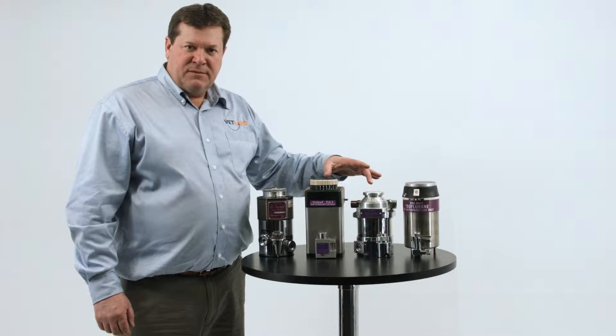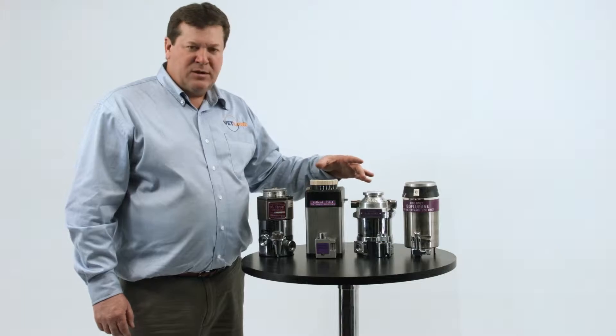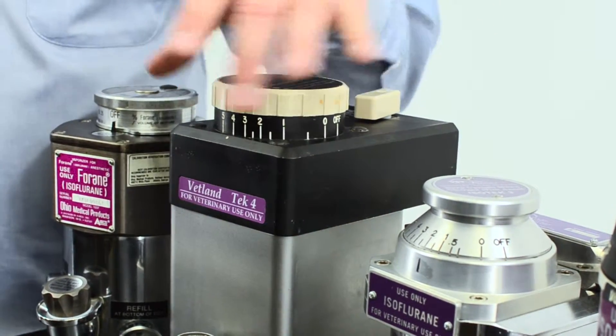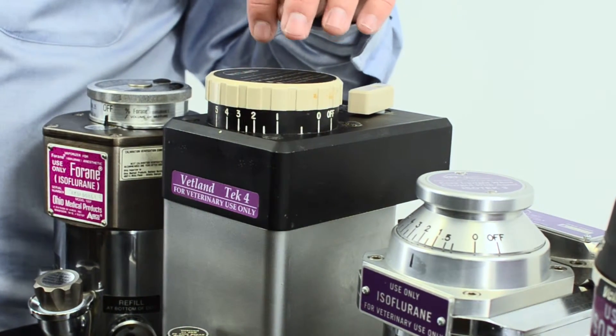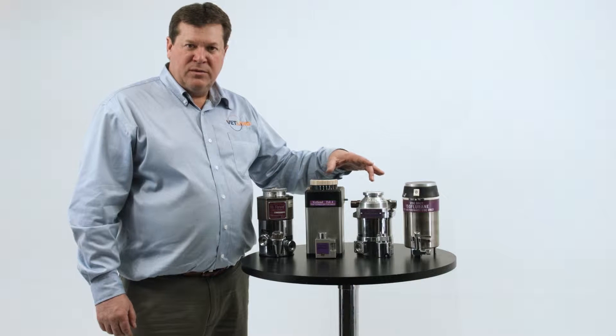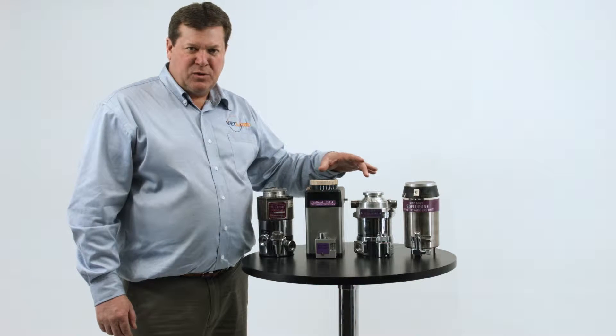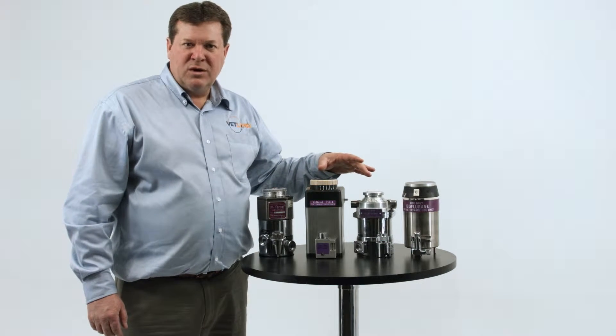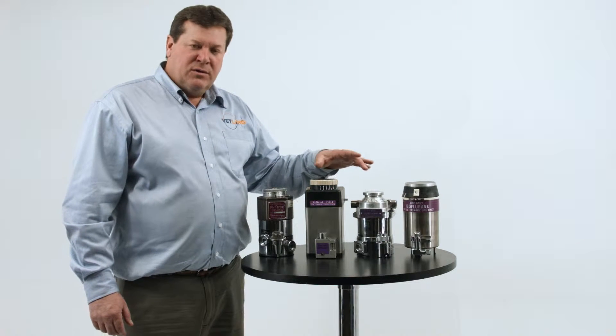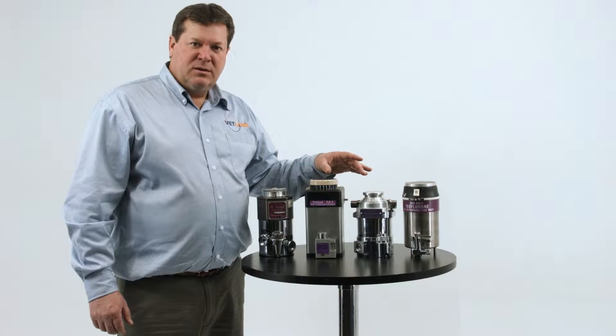The TEC-3 and the TEC-4 internally are basically the same components. The TEC-4 is more of a square shape and holds more volume of drug and it mounts differently, but internally these are both the same bi-metallic strip thermostats and a cotton wick fiber. These also need to be sent in every three years to be recalibrated and rebuilt.